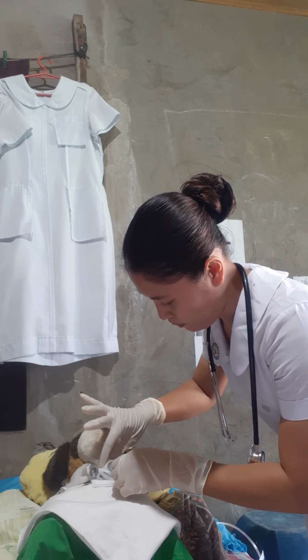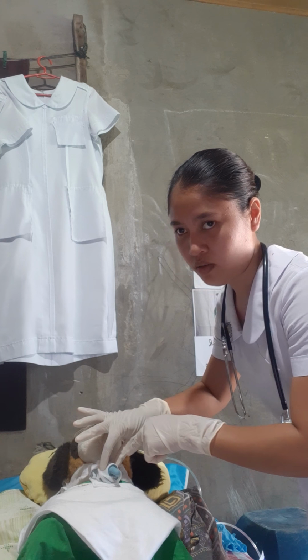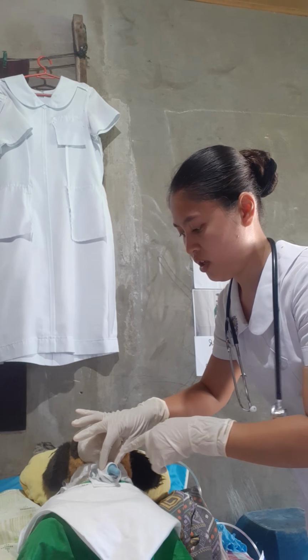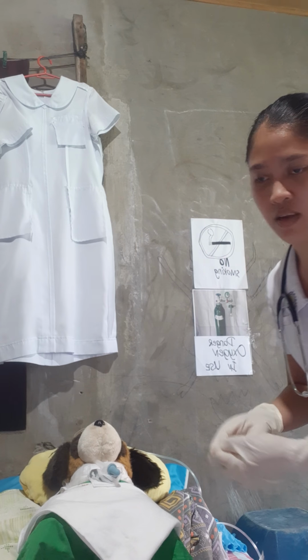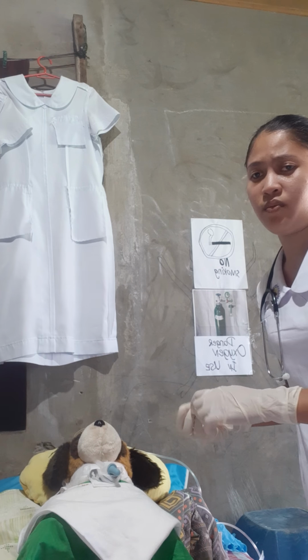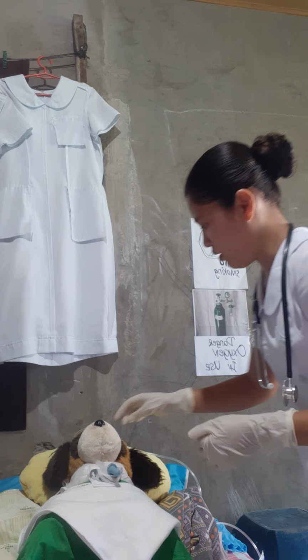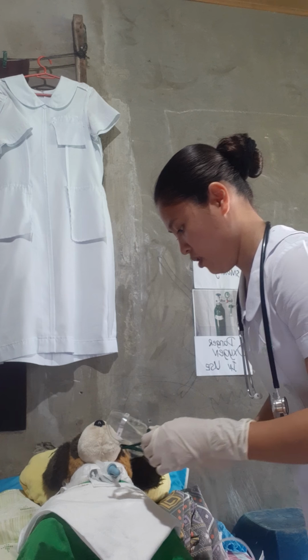Make sure that we are touching only the outer part, not the inside, because it is sterile. And after that, we're going to apply the oxygen.